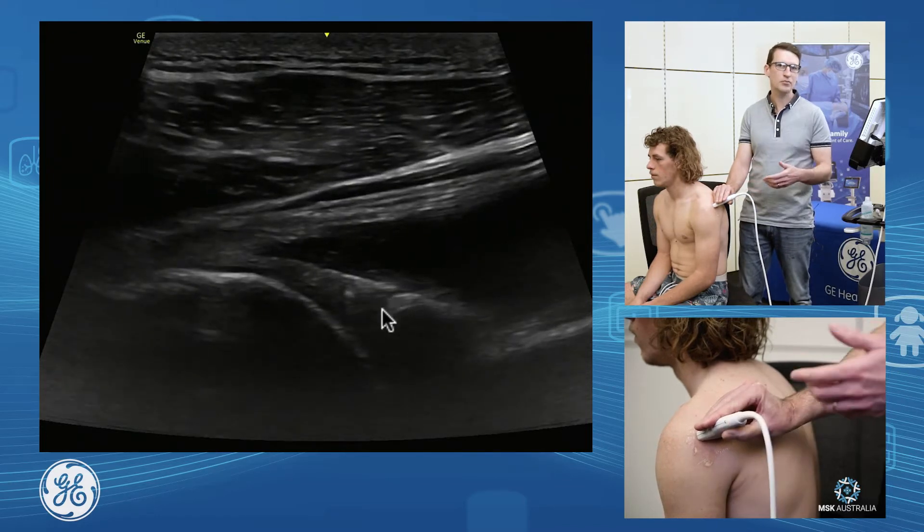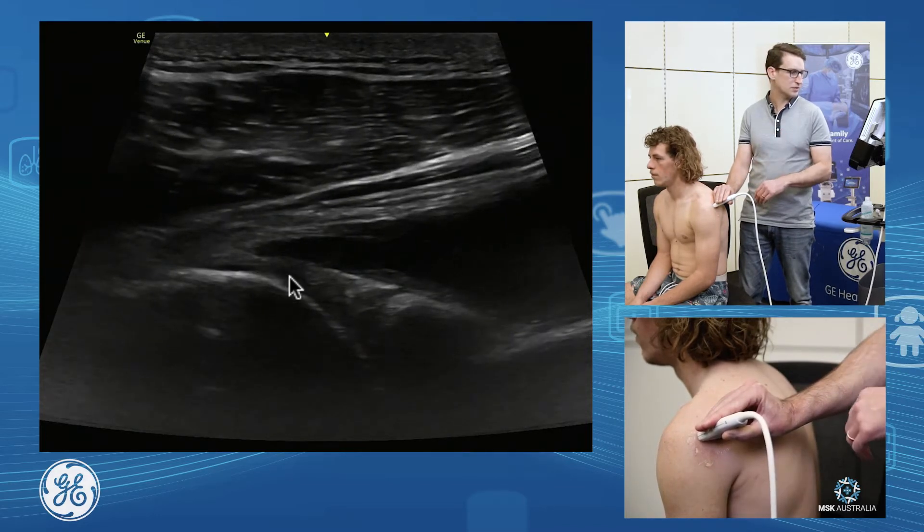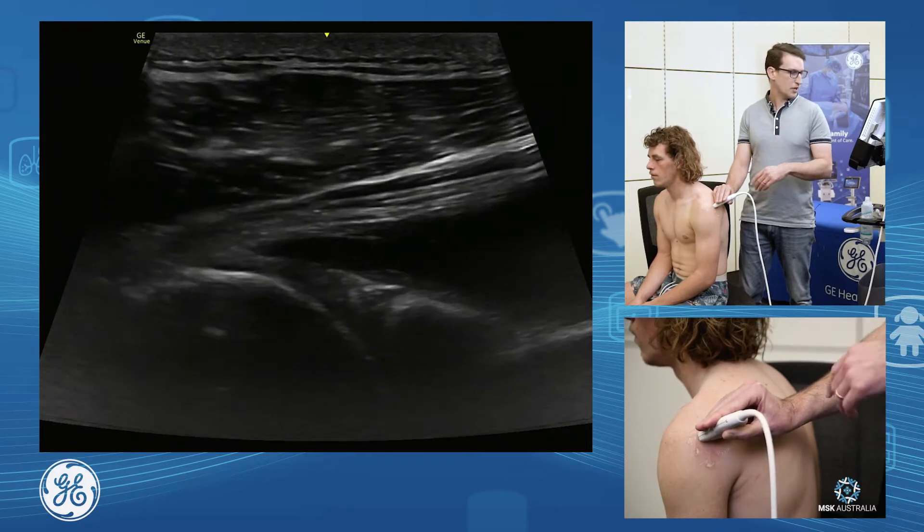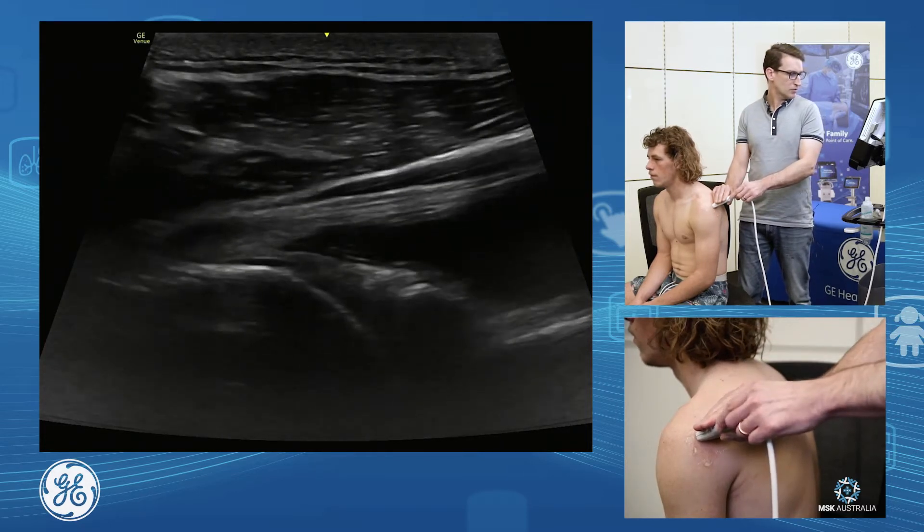We've got our glenoid, labrum, and our humeral head with its articular cartilage. I want to assess the full superior to inferior aspect of this glenohumeral joint.